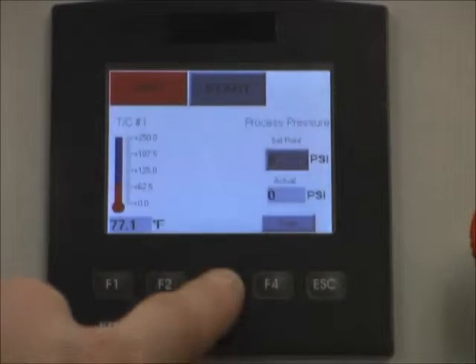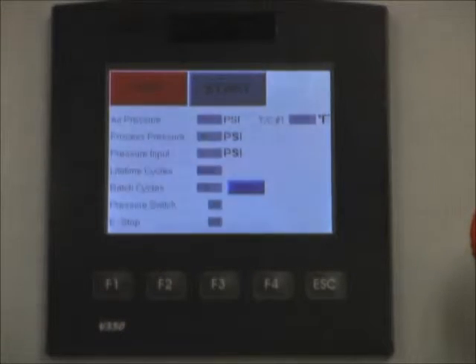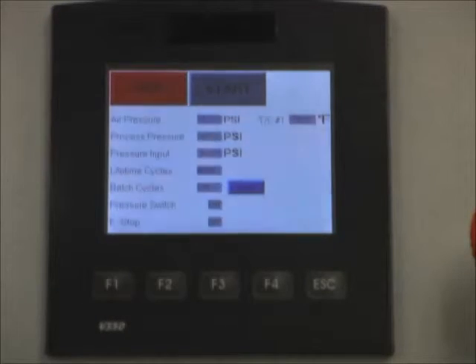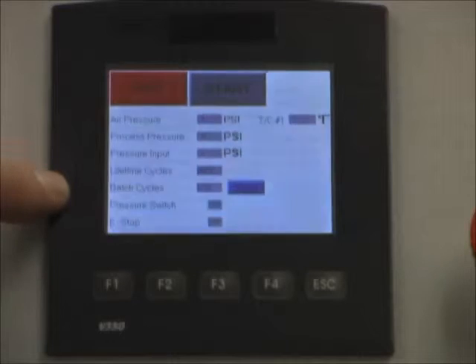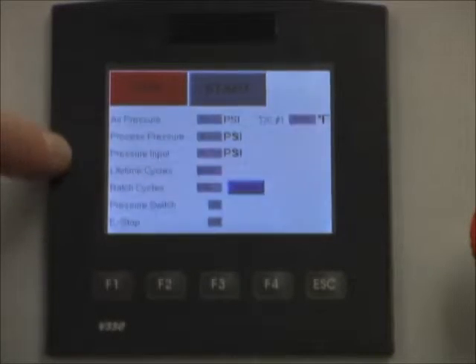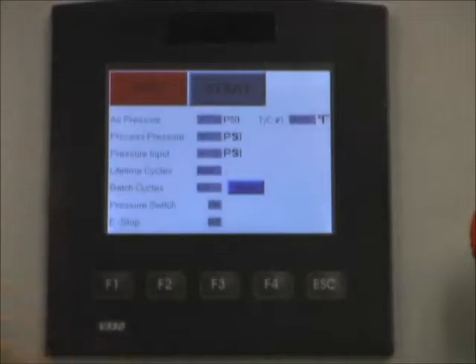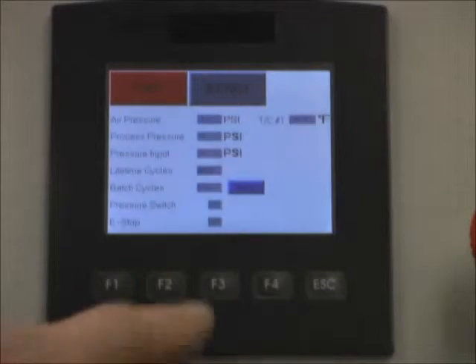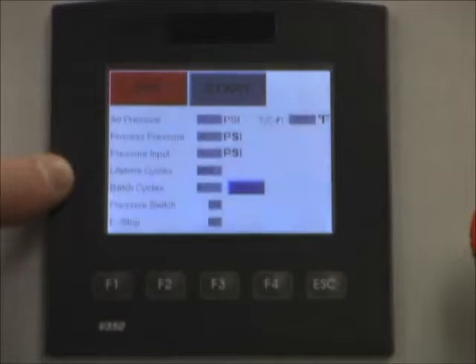Under the F3 screen, this screen again has the on and off controls on the top, and a general overview of what is happening in the PLC. A couple of the inputs and outputs are shown, as well as a batch cycle counter. There are also lifetime cycles for every stroke, and the batch cycle is resettable — we can hit the blue reset button and that will return it to zero.